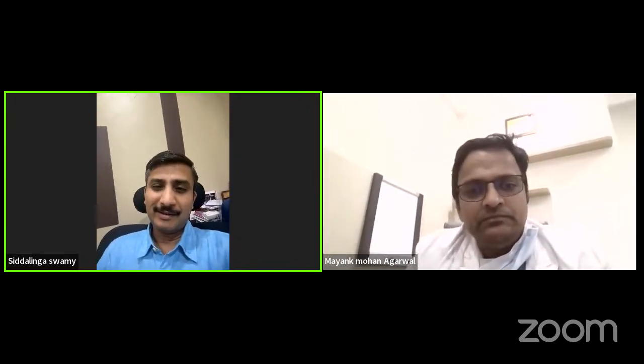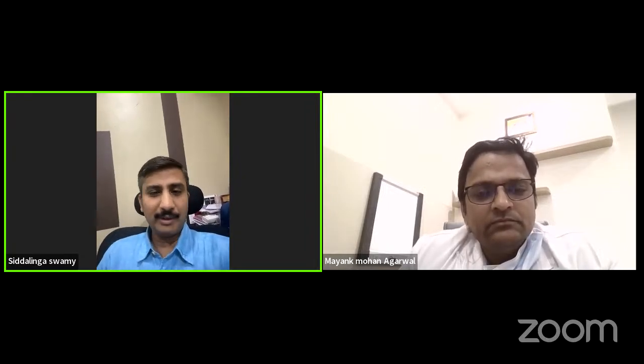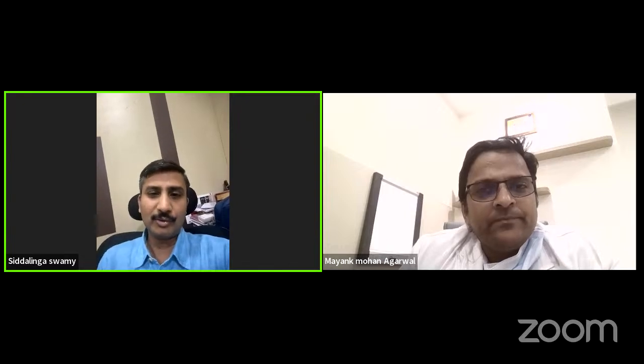Right, sir. That was an excellent talk, I have to say. You have condensed it in such a short and easily understandable way. I think anybody who wants to build up a setup for a urodynamic study, or who has started recently and wants to know how to report and everything, I hope that it helps.